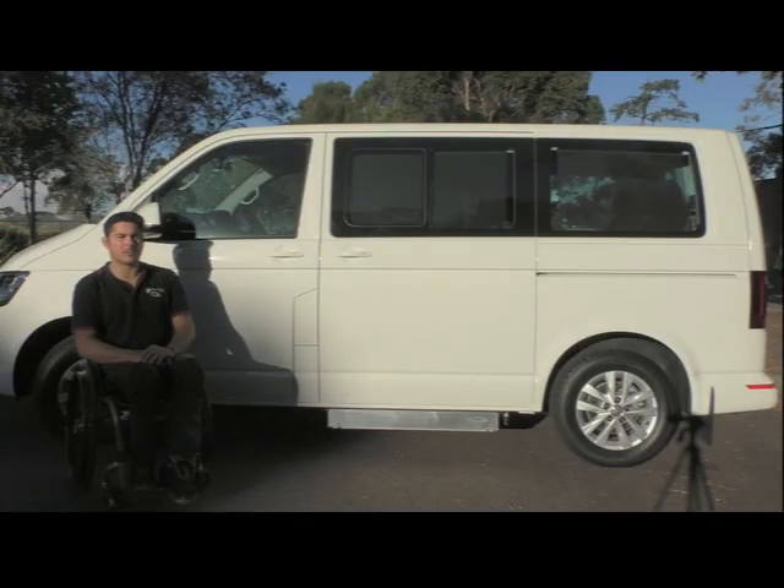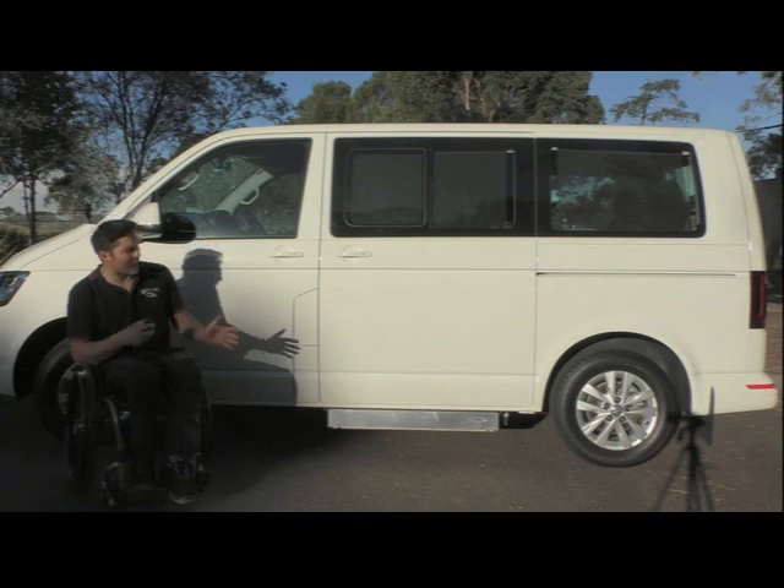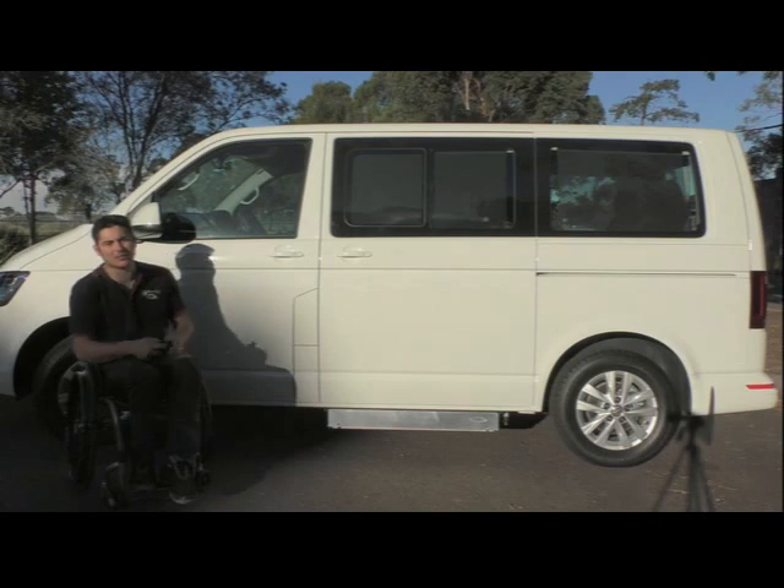G'day, Jerome from PMA Auto Conversions here, going to do a quick video for you today on one of our self-drive transfer vehicles. This is a VW T6 multivan that we've set up here. The self-drive transfer vehicle is one that you can access from your wheelchair but you drive from the standard driver's seat. It's good for someone that is capable with their transfers but maybe not so great at getting the wheelchair into the vehicle.